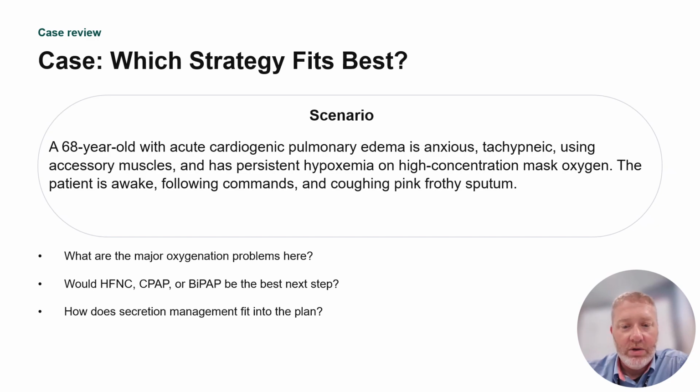What the CPAP will do by creating continuous positive airway pressure is it holds the distal lung fields open and indirectly pushes off fluid that's accumulating in between.